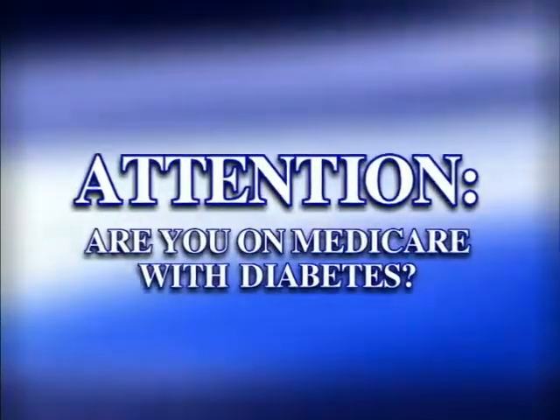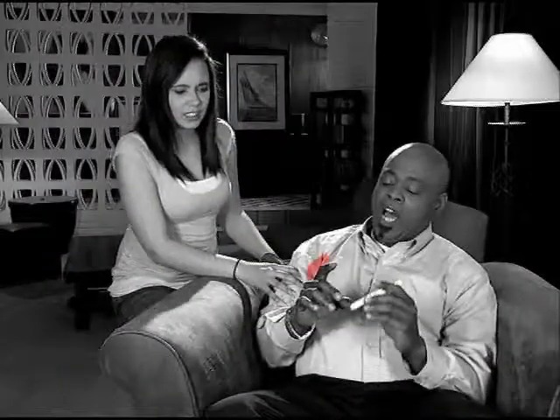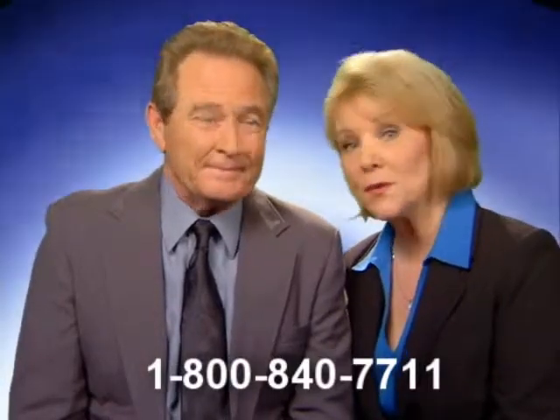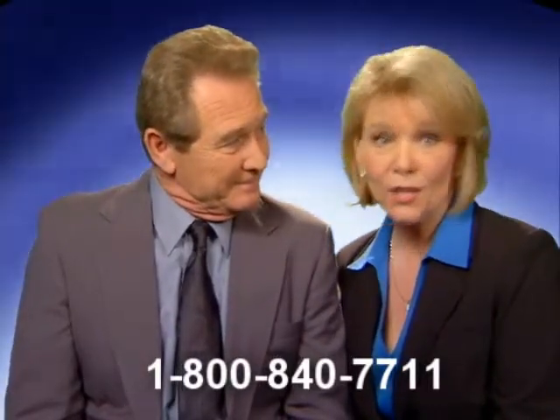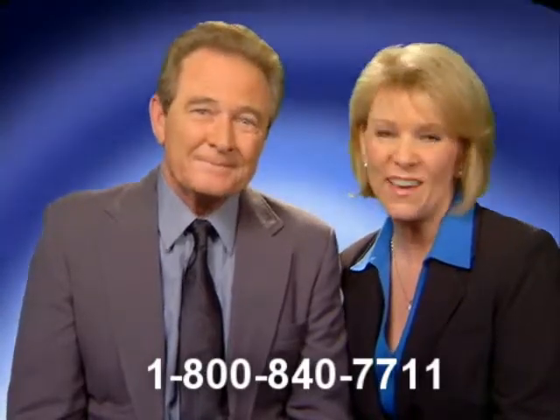Attention those on Medicare with diabetes — you may be eligible for an upgraded meter. If you're tired of stabbing your fingertips to test your blood glucose, we have news that could change your life. Because if you're on Medicare with diabetes, you need to know there's an alternative method for checking your blood glucose every day.